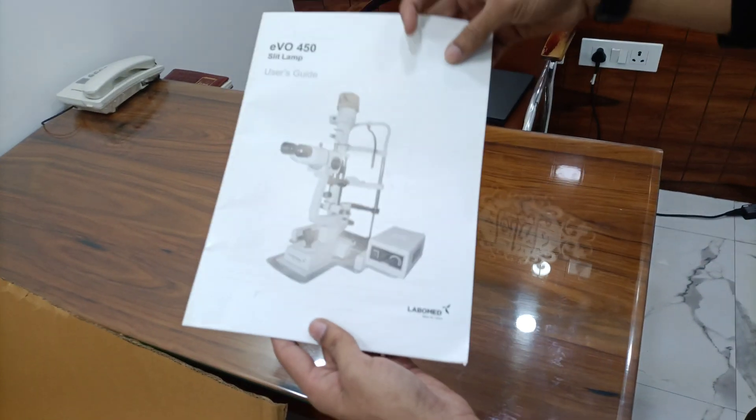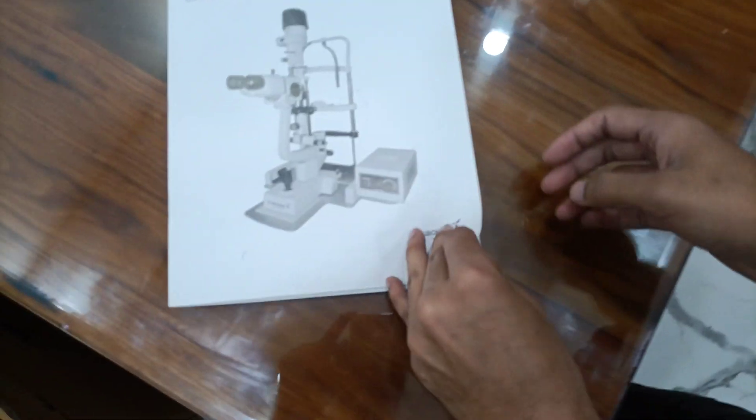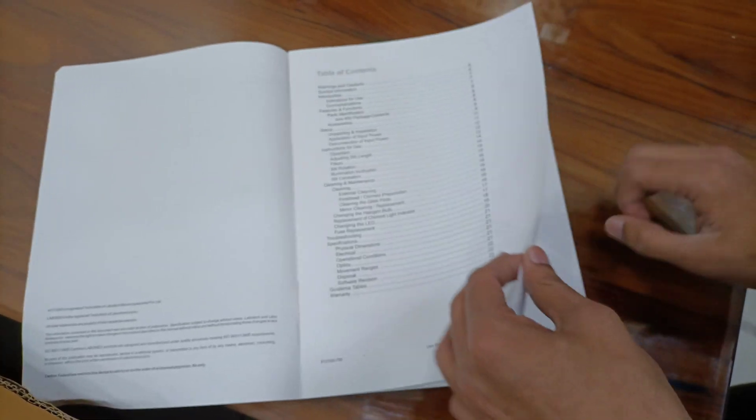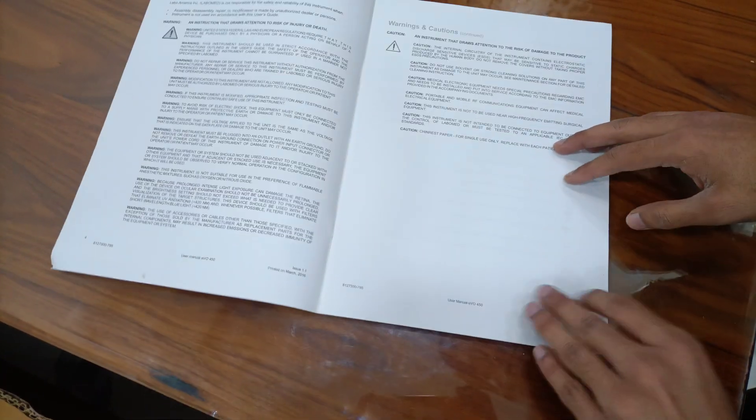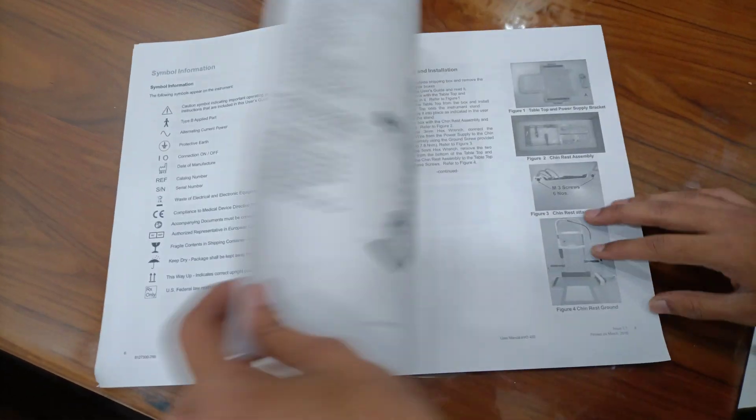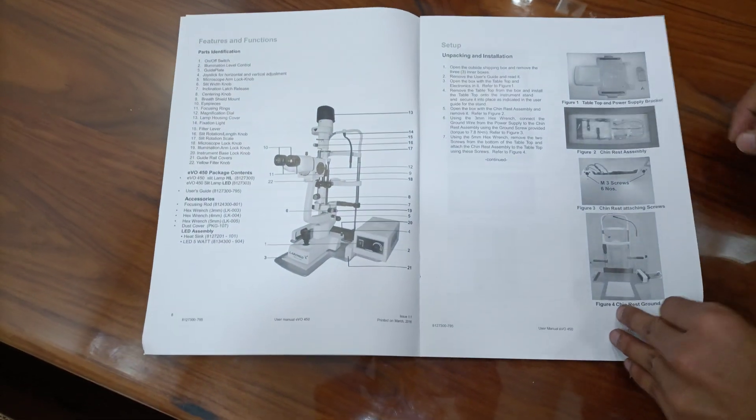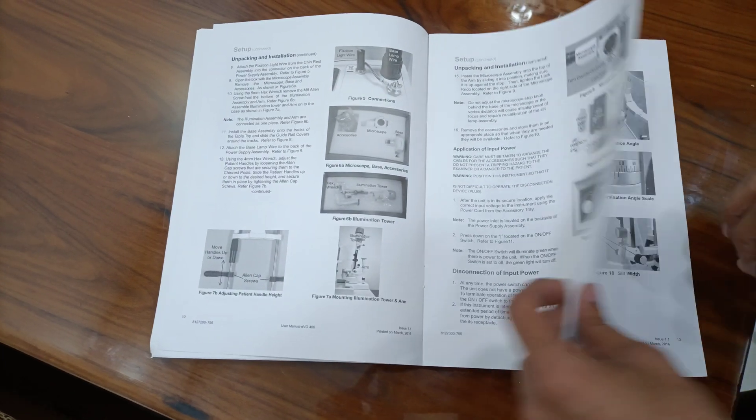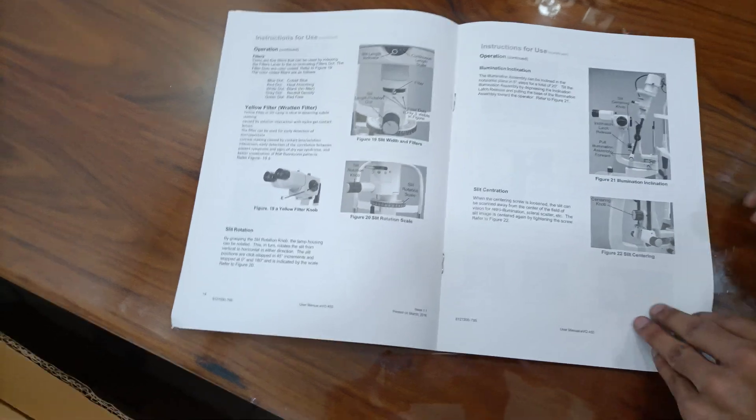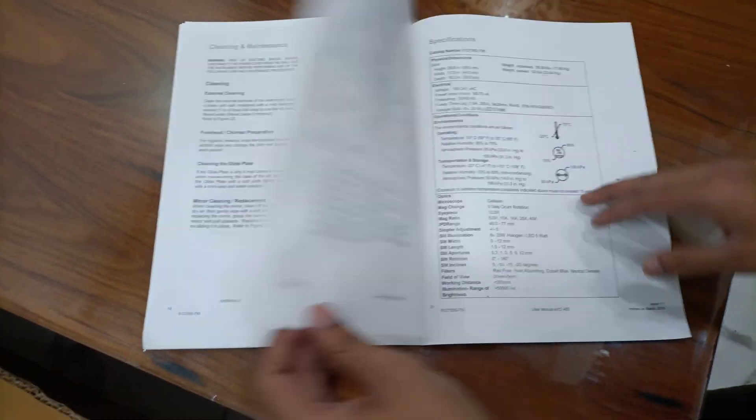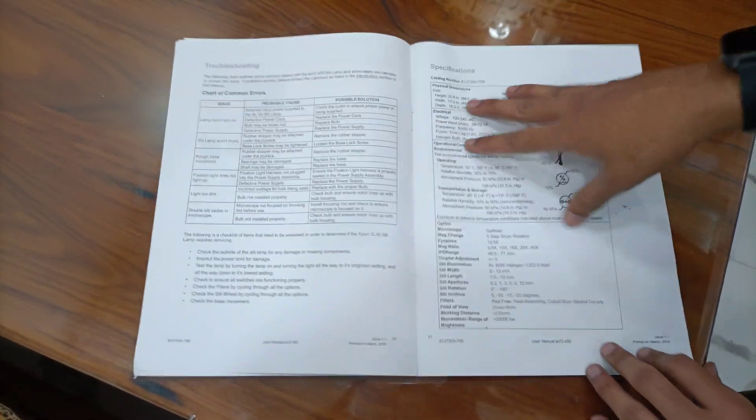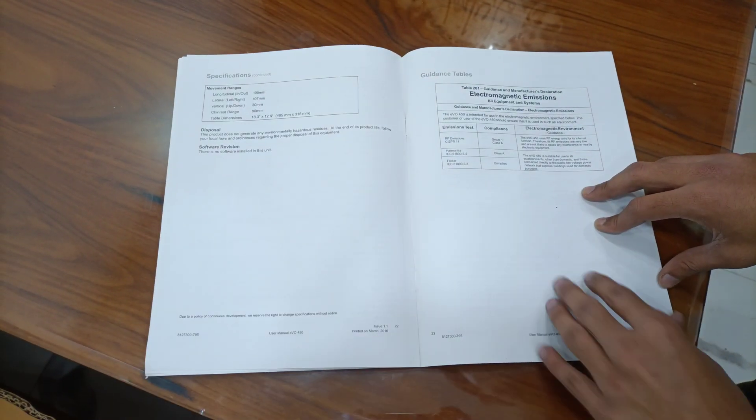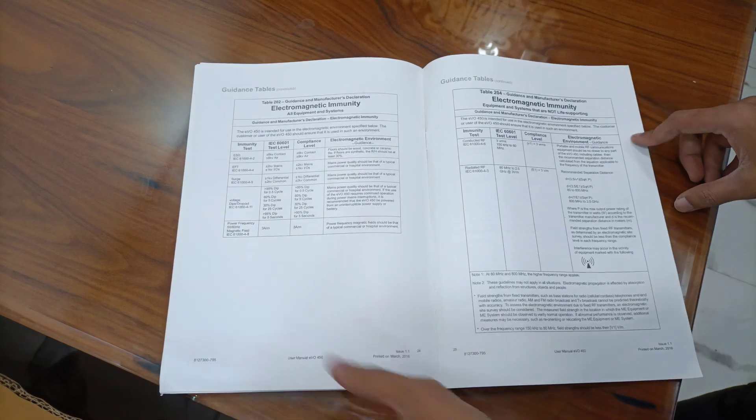User's guide EVO 450. I will show you like here is the parts available, accessories available, how to work, how to install, instructions. Voltage, conditions, dimensions, everything available.